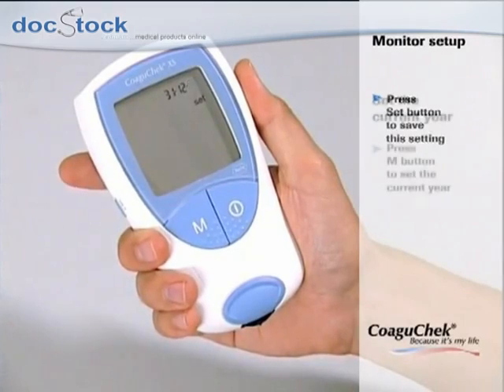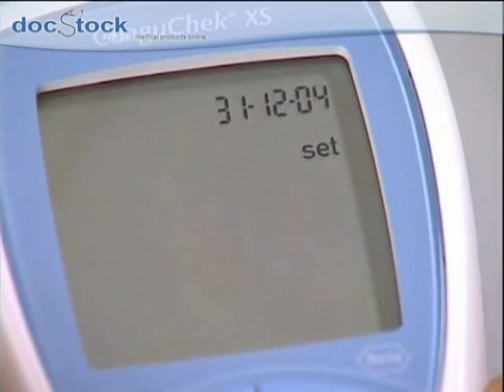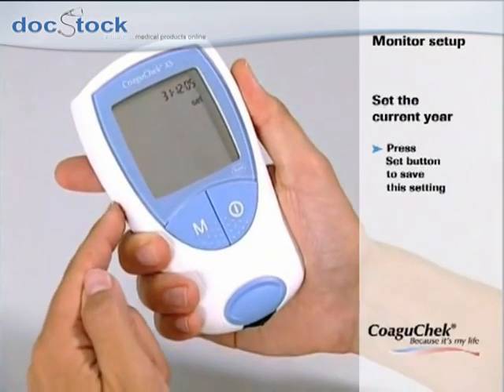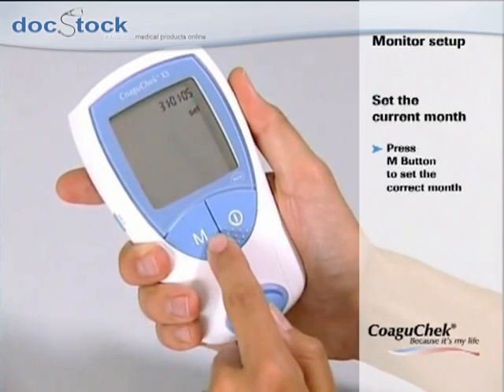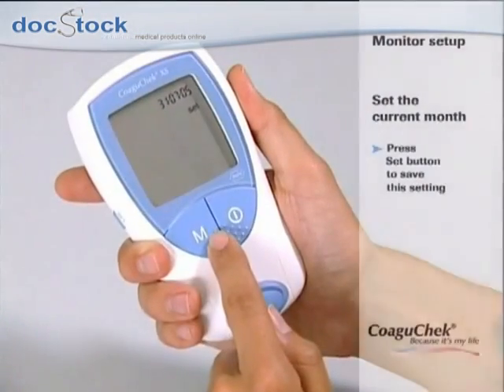The next step is to set the current year. Press the M button to change the flashing number until the correct year is displayed, and save your setting by pressing the set button. Now the preset month is flashing — press the M button until the correct month is displayed, then press the set button to save your setting.